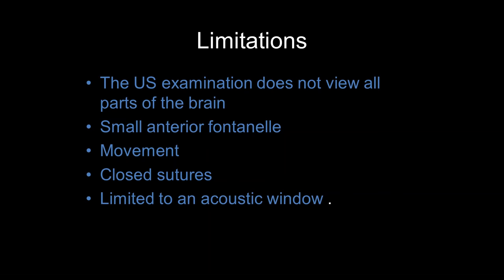Wonderful. All right, so we've got another question for you. What are your thoughts on newborn or infant ultrasound for increased head circumference? Right, okay. I think that if a baby has crossed a centile and they still have open sutures, a cranial ultrasound scan is the best way to assess those infants.